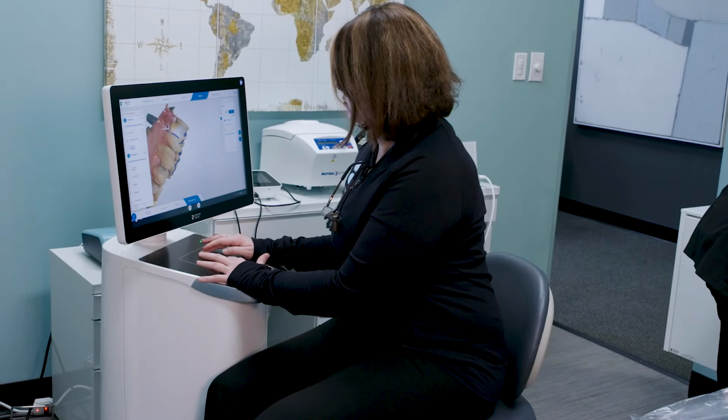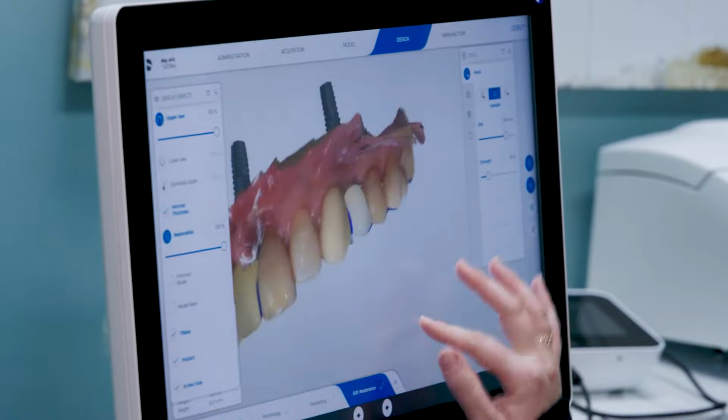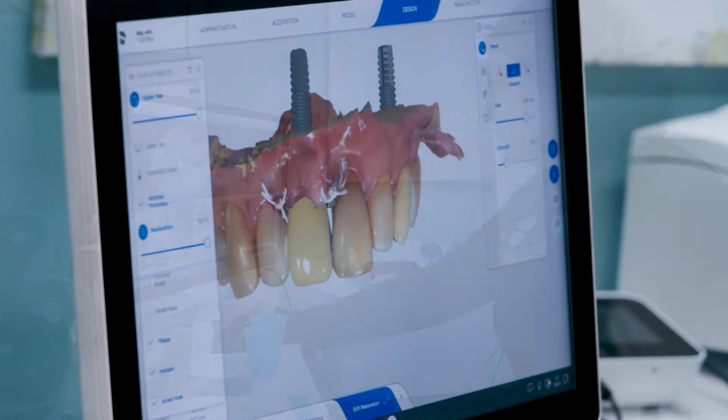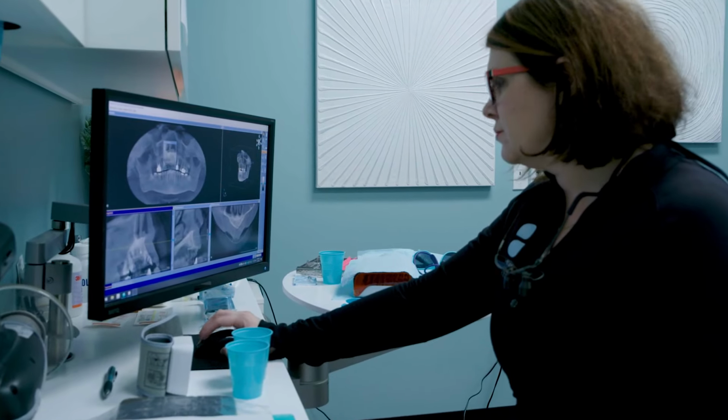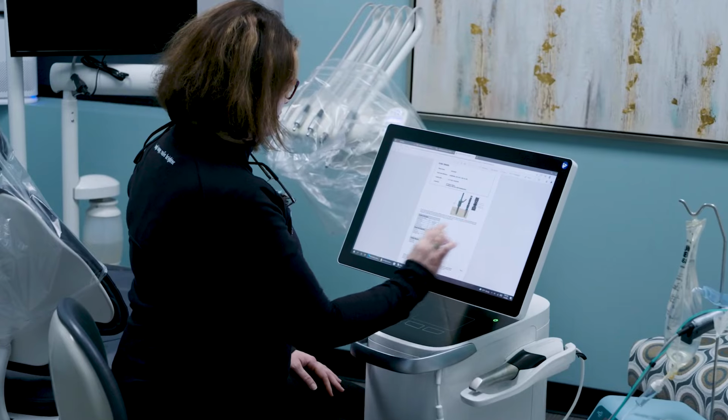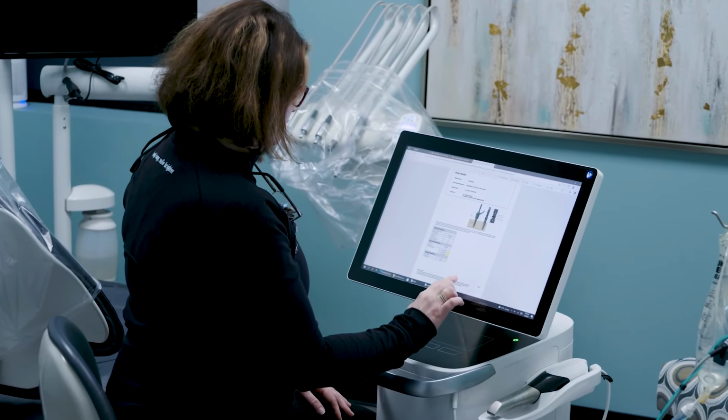Guided surgery for me gave me a little bit of security, and it did that in a couple different ways. One, just having the guide already planning the implant on the computer, and I can do that either by myself and make my own guides, or I can use a third party to help me with the guide. The advantage of the third party is that I have someone else with eyes on it that see implants every single day. And they virtually place the implant, but I have total control over it.